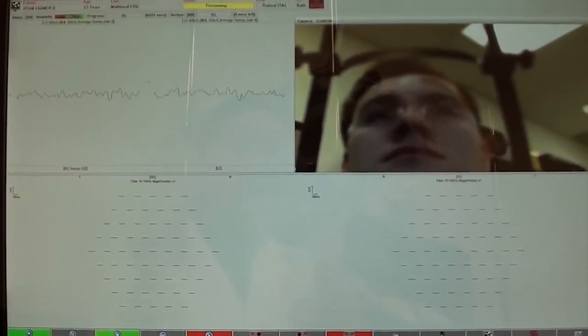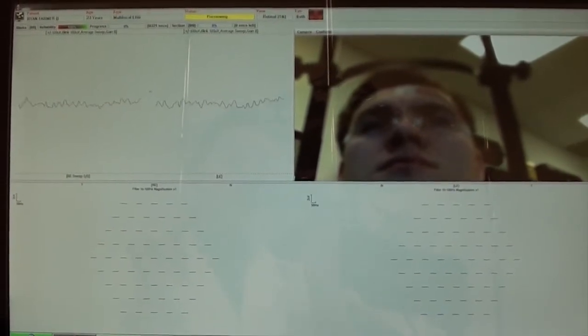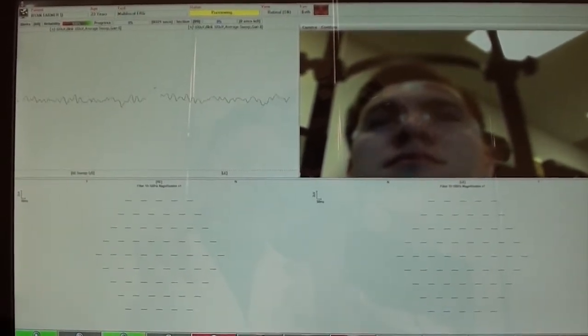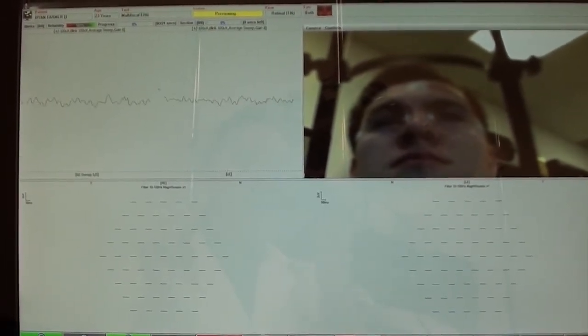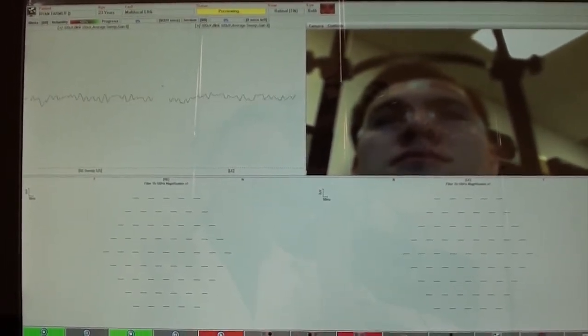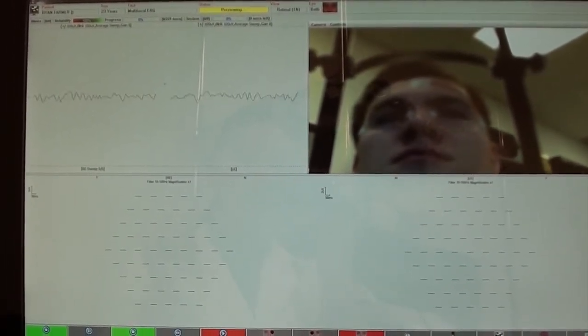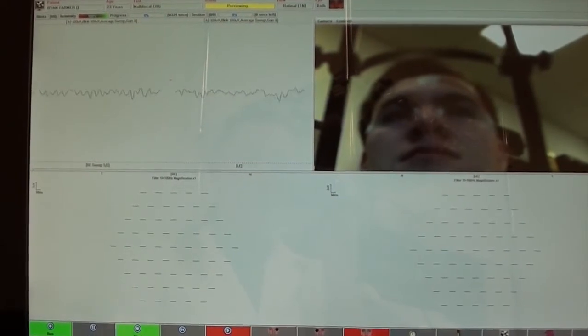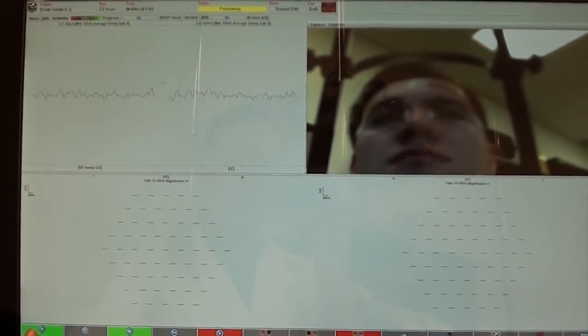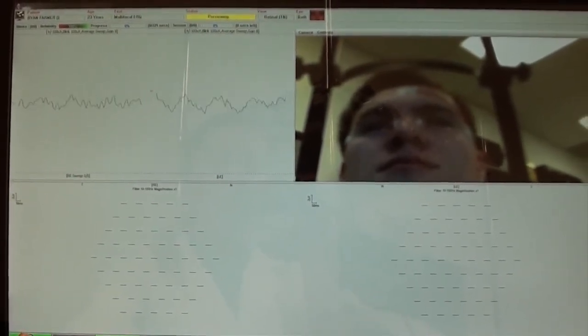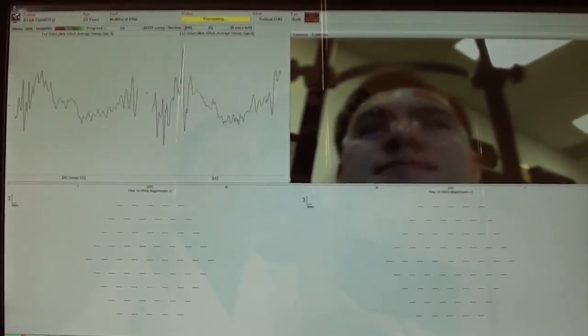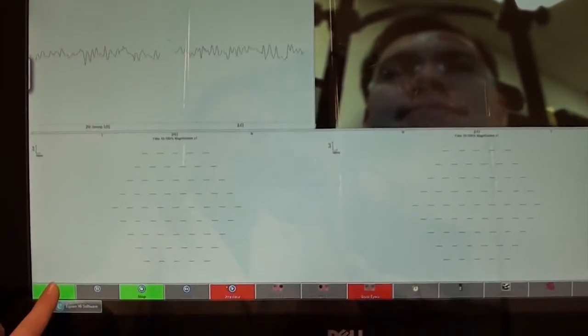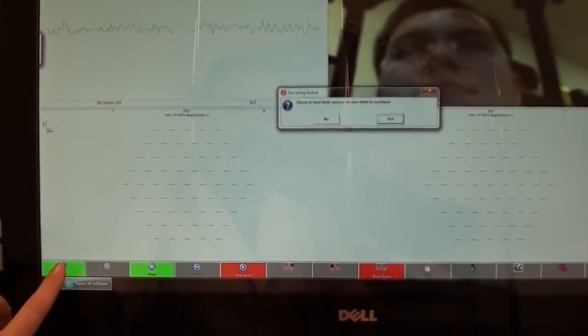We tell our patient to sit still, look straight at the X, try not to move, and try not to blink. Is our patient ready? Yes. Then we click on run.